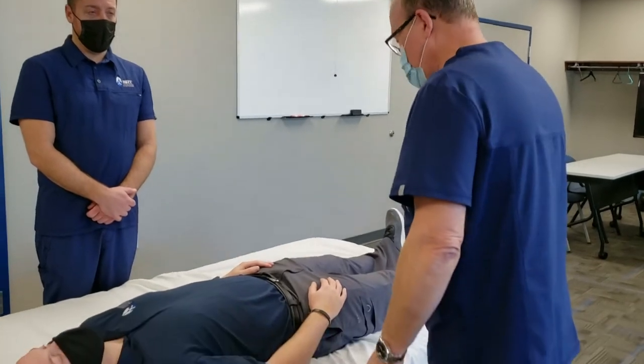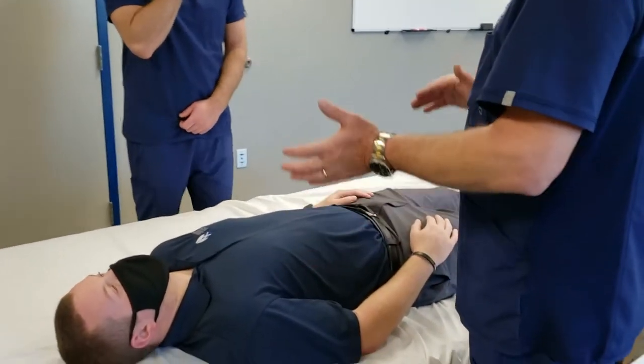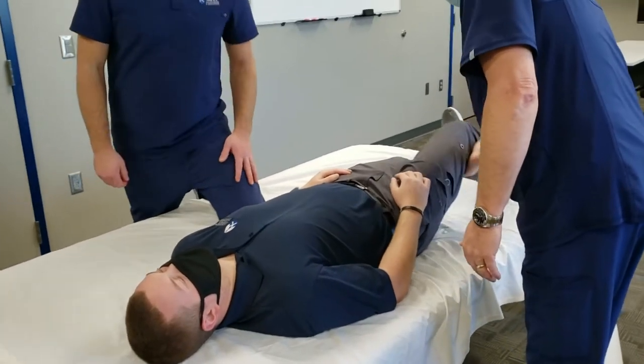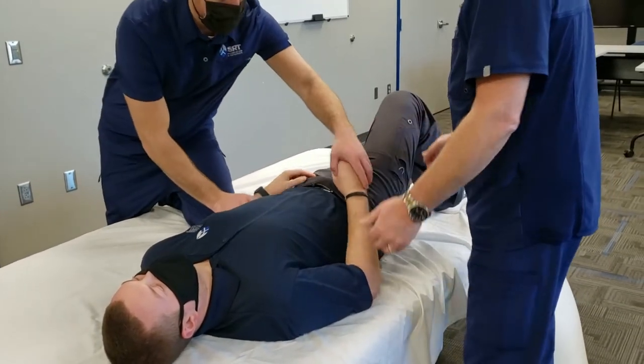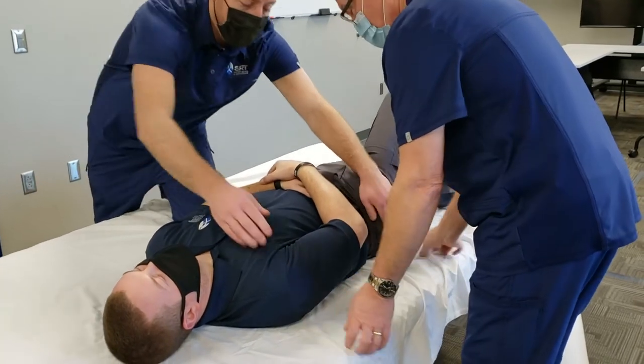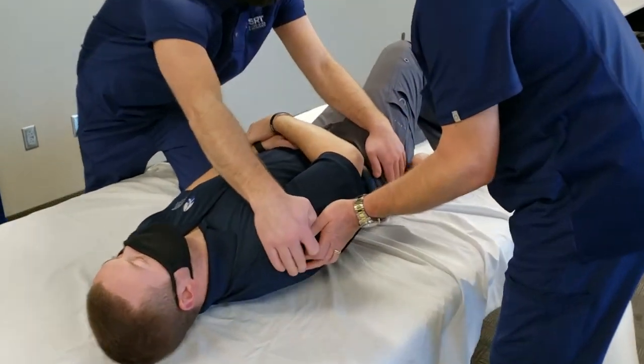The first thing we're going to do is log roll the patient to put the back piece behind them. We're going to have the patient raise his knee opposite of the way he's going to turn. He's going to reach across with a hand and then roll to — in this case — the right side.